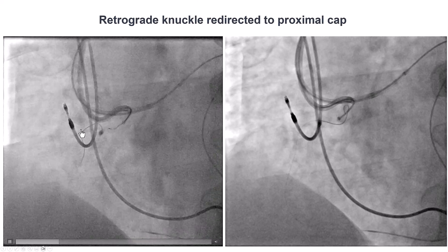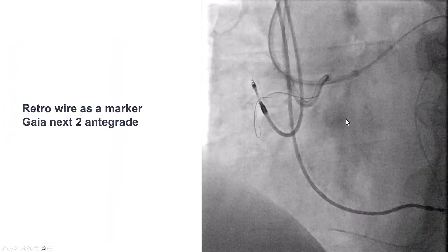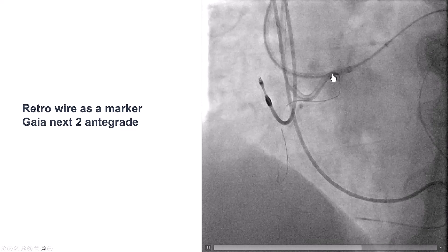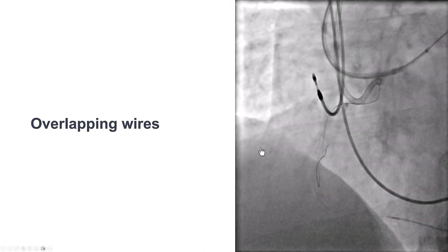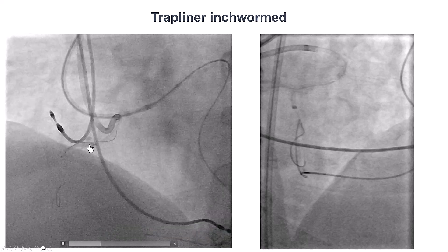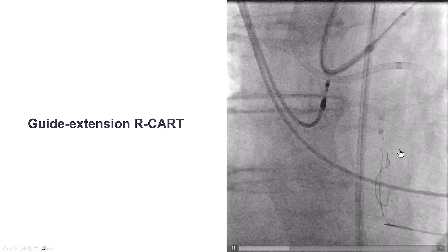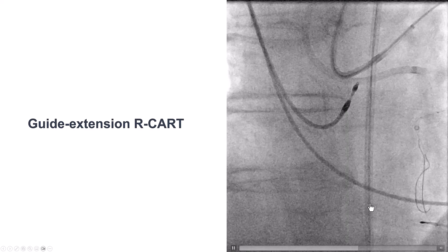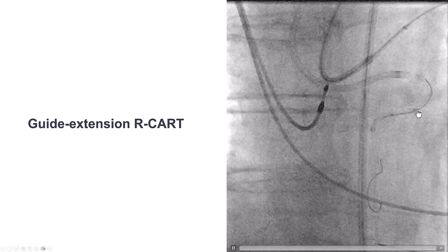Eventually, we inserted the retrograde knuckle wire a little bit closer to the proximal cap and then tried to use another antegrade guide wire — a Gaia Next 2 advanced antegrade. After multiple attempts, we were able to make the antegrade wire knuckle along the course of the retrograde guide wire, achieving overlapping guide wires. We advanced the guide extension using the inchworm technique further down into the occlusion, and were then able to advance the retrograde guide wire using the guide extension reverse CART technique into the antegrade guide extension. This was the turning point — the retrograde wire entering the antegrade guide extension.